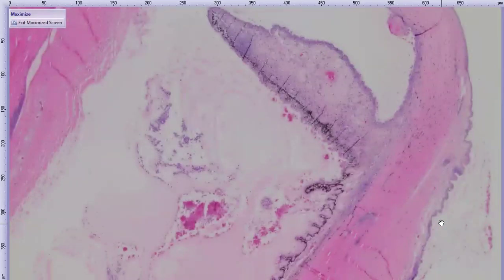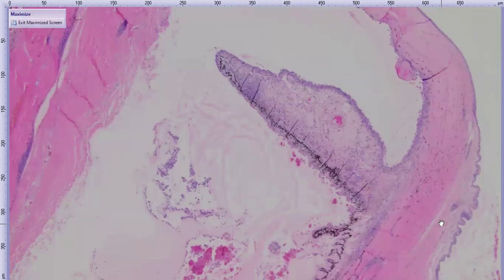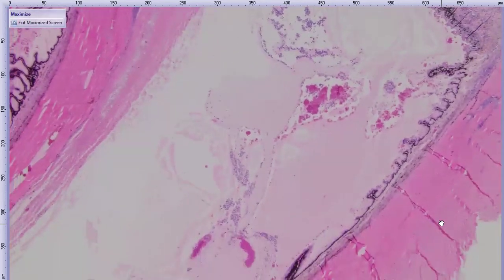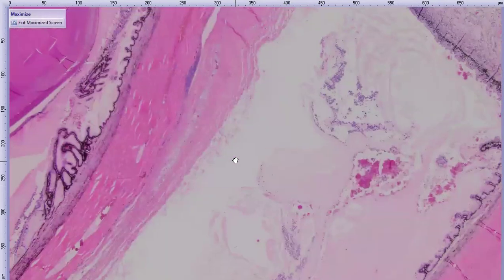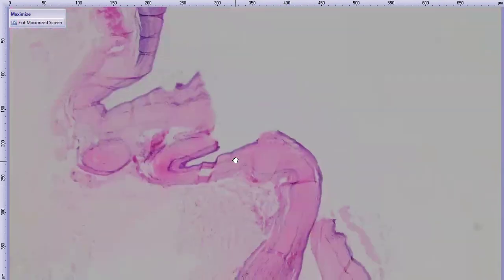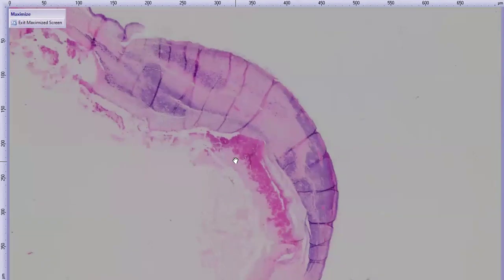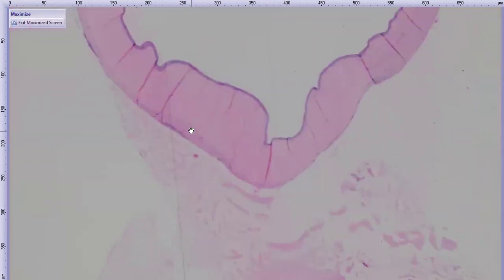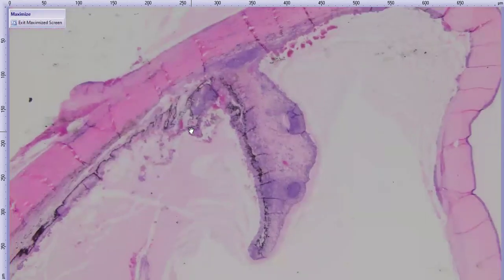I'm going to go straight to the low magnification view. We definitely have too many cells kind of carpeting our uveal surfaces, free floating in our chambers here, mixed with blood. So too many cells, lots of purple. We'll quickly head to the cornea, where there's something quite unusual going on. There's this vast expanse of empty pink surrounded by way too many cells again. We'll come back to that. Again, really inflamed looking uvea.